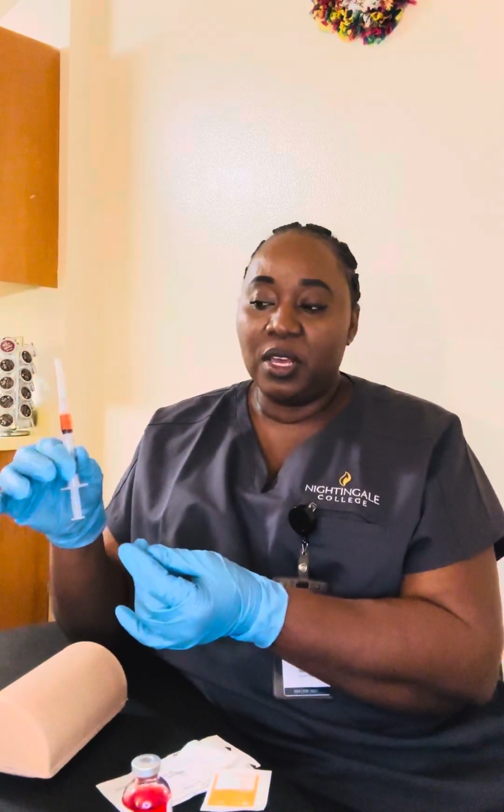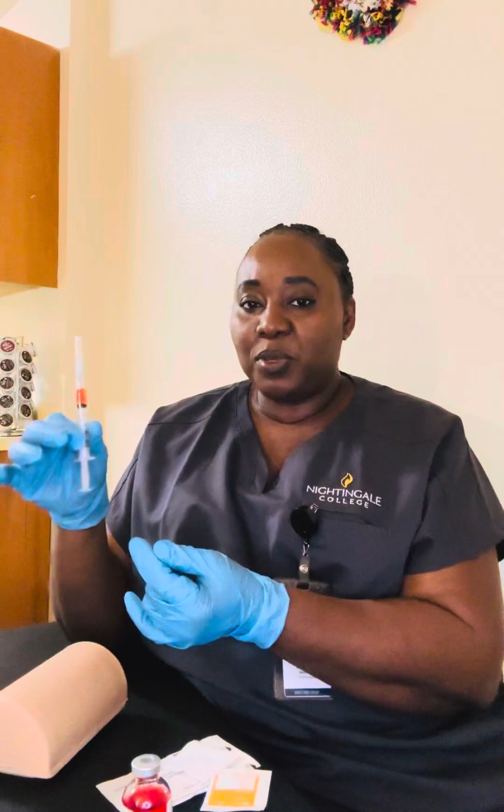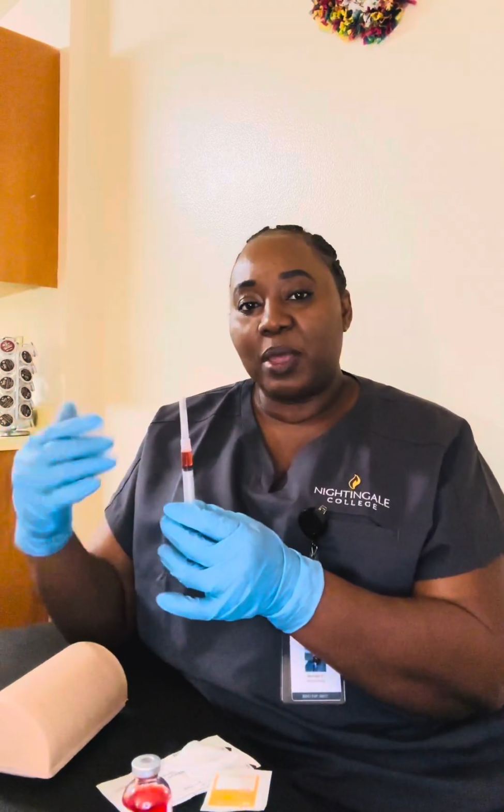At this point, I'm going to do my third verification with the MA to make sure I have the right medication, which is heparin, the right dose, which is 1 ml. The route is subcutaneous. The time is now because it's 1 dose, and I'll do the documentation later. I have the right patient in front of me because I've identified them 2 ways. Once that is done, I'm going to set all my material aside.